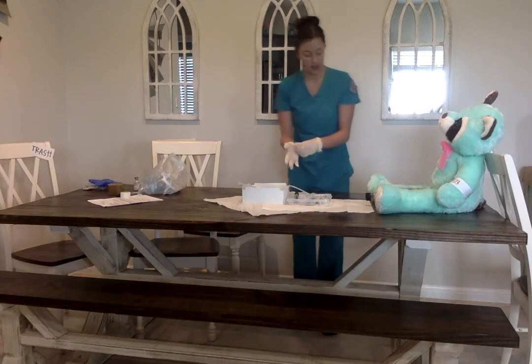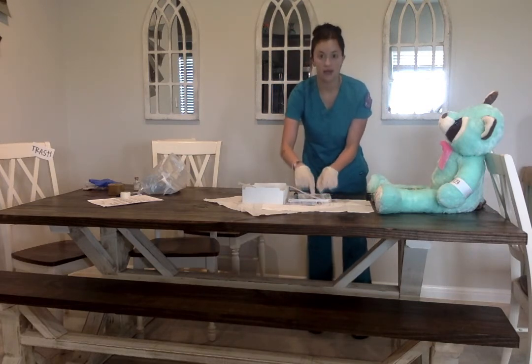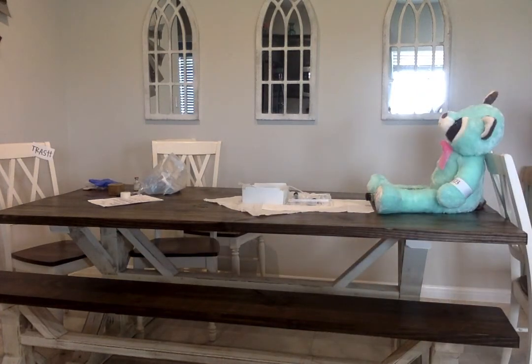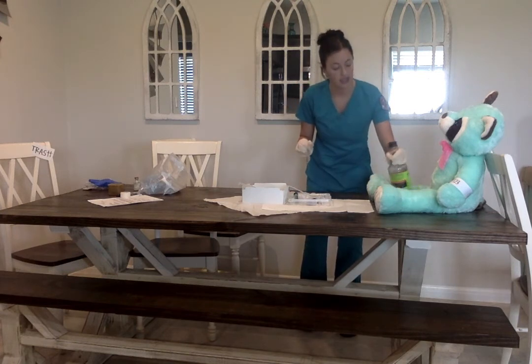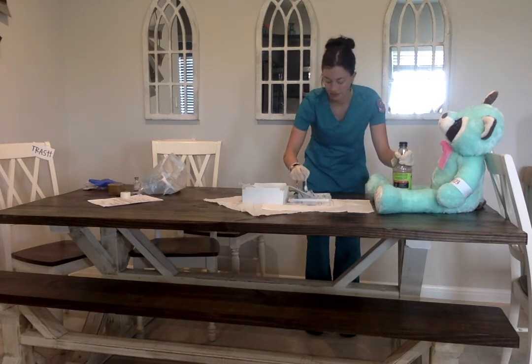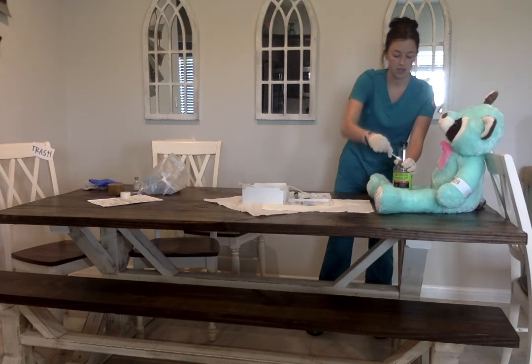Alrighty, I'm going to clean, or not clean, but sterilize. Sorry. Going to sleep on you, my computer. I'm going to grasp the penis and hold it at a 90-degree angle. And I'm going to clean from top to bottom. Starting at the top, working downwards.